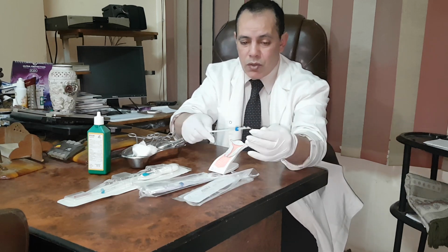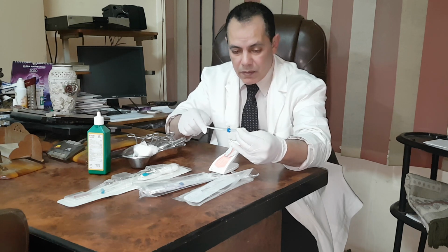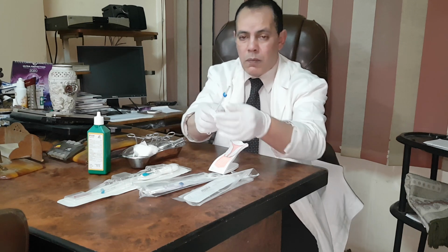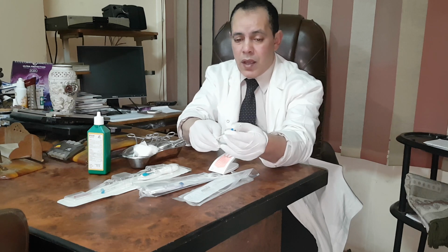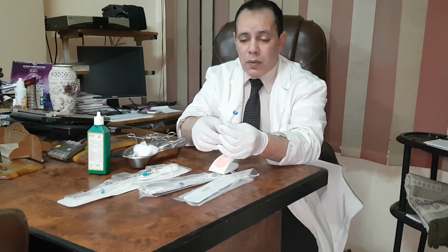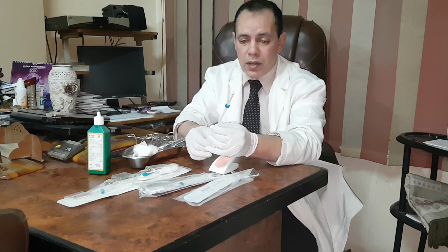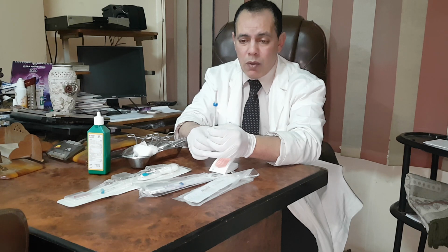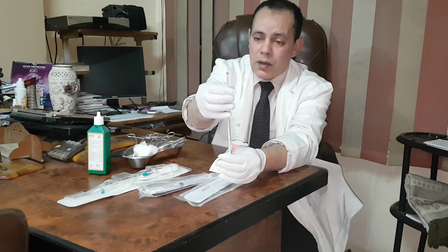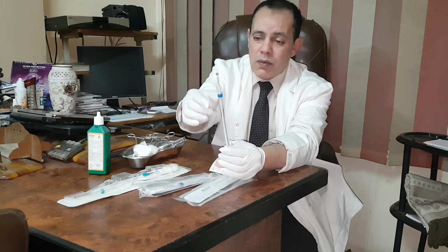And before doing this, you should insert the two transverse arms inside the sheath, like that. I insert one of them, I insert the other. So both transverse arms should be inside like that. Because insertion of Copper T 380 inside the uterus is done by a technique called the withdrawal technique. I insert the plunger till it reaches the last part of the vertical arm. As you see here, the plunger is inside, just touching the vertical arm. Okay? This flange will be measured according to the length of the uterine cavity.